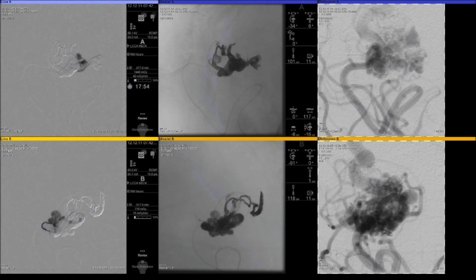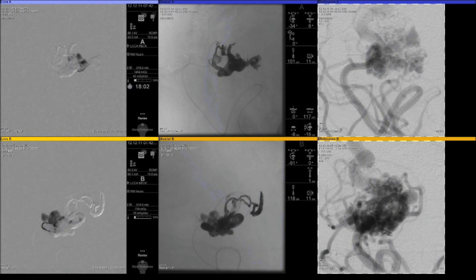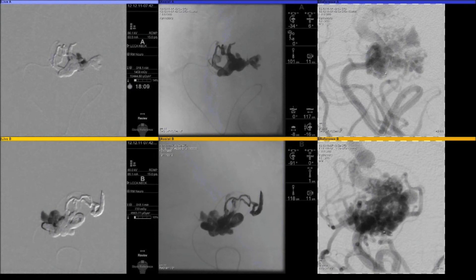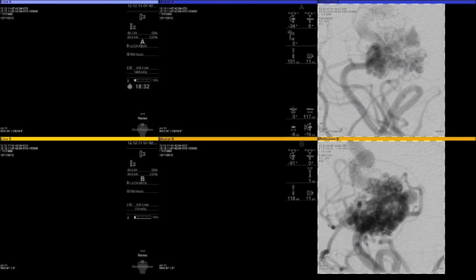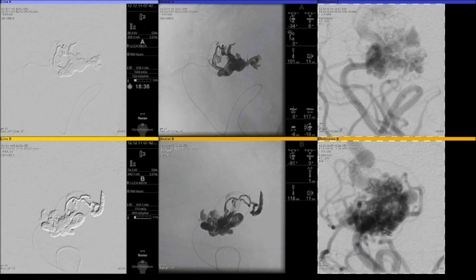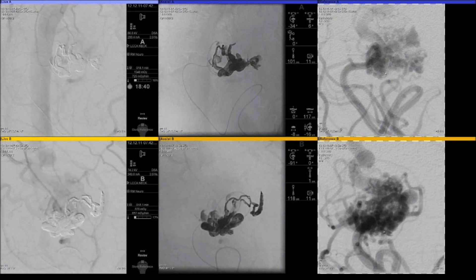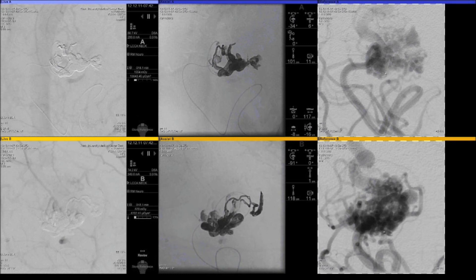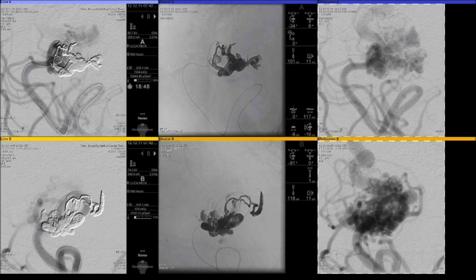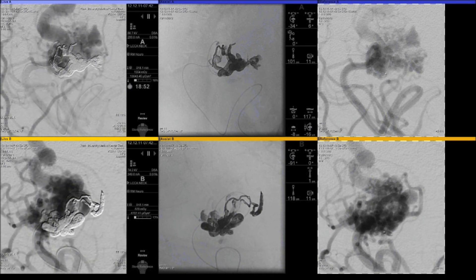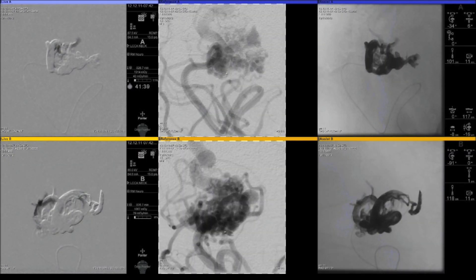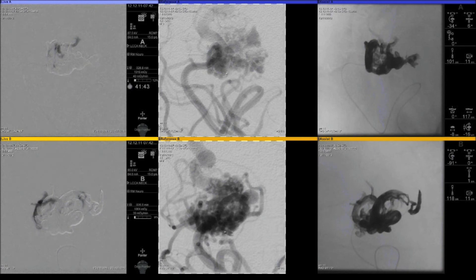You can gradually start to sculpt this nidus using the Onyx. The key is to avoid too much reflux. It's also very important to not let too much Onyx get into the venous side, as you can lose a lot of embolic material there. When you recognize you've reached the venous side, interrupt your embolization and reroute into a different portion of the AVM. If the liquid embolic goes in the wrong direction, I tend to wait 30 seconds to 2 minutes before starting a new injection.